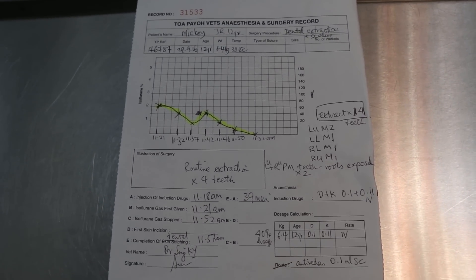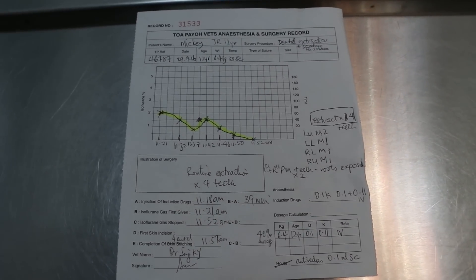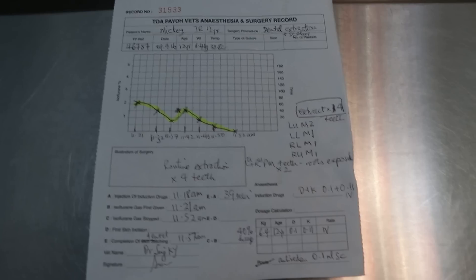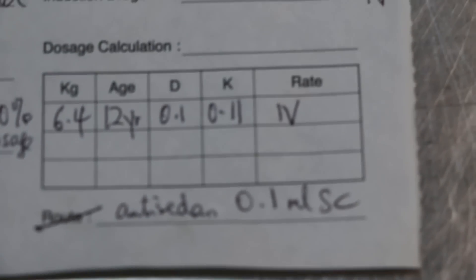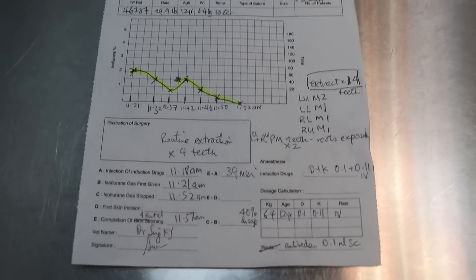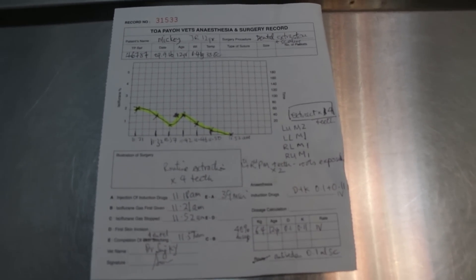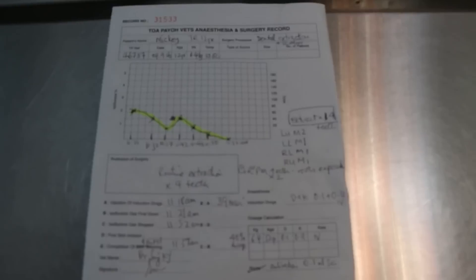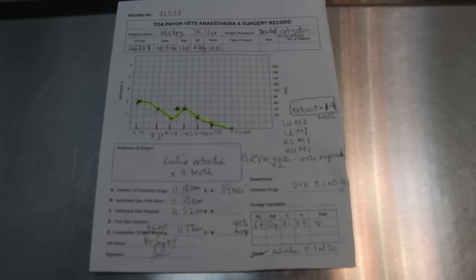The dog is okay — he's awake. He has woken up. I have given antisedan as well to reverse the Domitor effect. There is a drip, and then painkiller and antibiotics. The advice is to give soft food for the first four days and painkillers for about seven days. Dental scaling in a very old 12-year-old Jack Russell, Singapore. This is the anesthetic and surgery records.